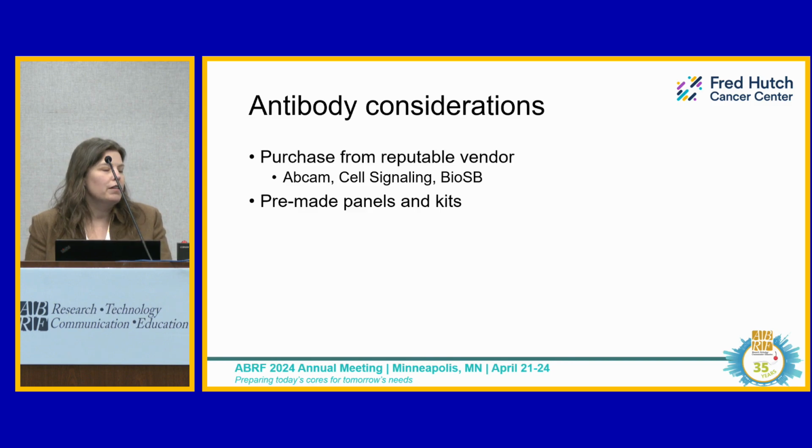There are pre-made panels and kits. This can be a really useful way to start if you don't have anything established in-house. You can start with a pre-made kit and then start to develop your own customized panels as time goes on.